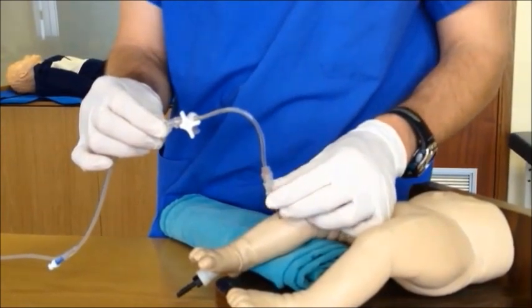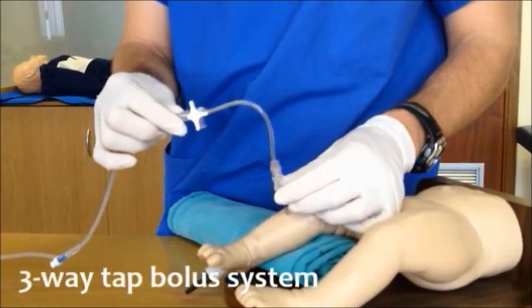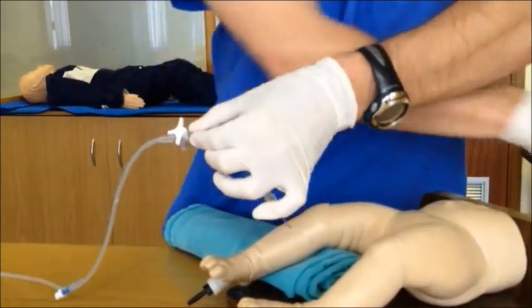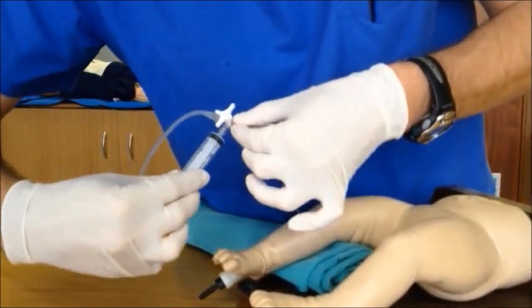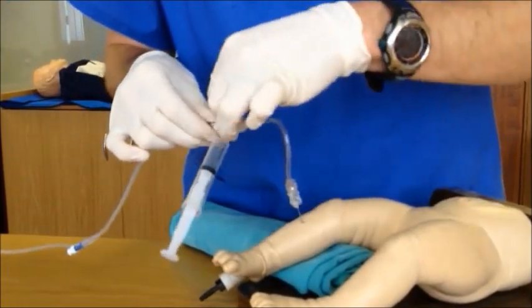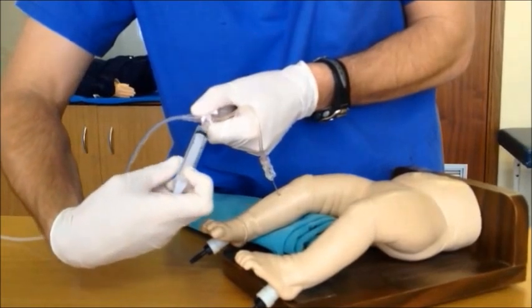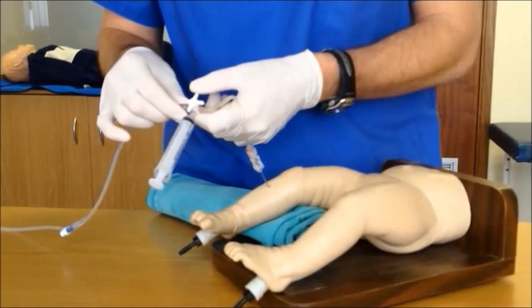It's very important to note that gravity alone is not enough to infuse fluid into the patient — you would have to use a three-way tap bolus technique to do that. Make sure that the tap is open to the syringe port and open to the intravenous fluid bag. Attach the syringe to the port and aspirate the required amount of fluid from the bag. Now make sure that the system is open from the syringe to the patient and deliver the fluid as needed. This process can be repeated over and over and the side port can also be used to deliver medicines.